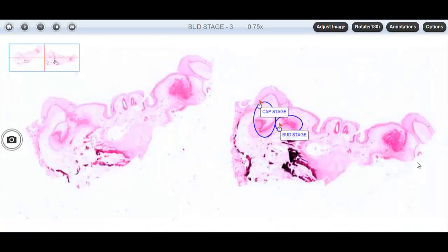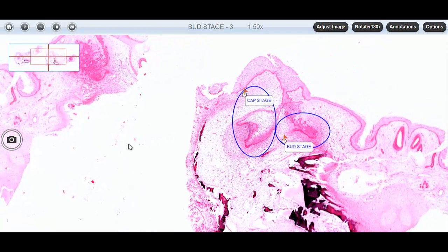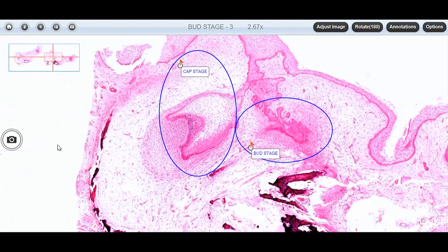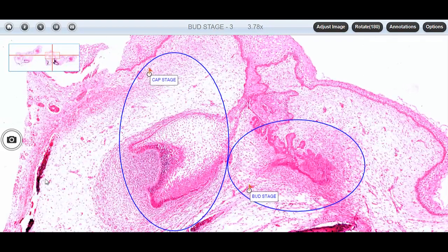We start with the bud stage. We have the bud stage here, and simultaneously we are seeing the cap stage. We can go to various magnifications as I said with digital slides, and see all parts of the slides. Here we have the surface epithelium and the extension of the epithelium from where the tooth bud is arising — this is the bud stage of the tooth germ. And here we are seeing the cap stage of the tooth germ.